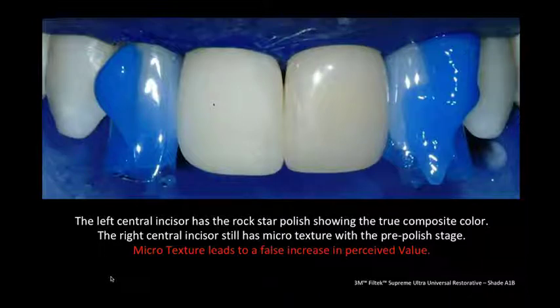Here, what I have is a case that's in mid-treatment. So the left central incisor has the Rockstar polish showing the true composite color. The right central still has some microtexture because it's in the pre-polish stage, just before I hit it with the diamond impregnated polisher. And you can see that even at this fine texture, there is a definite difference in the perceived values. The value of the unpolished restoration is quite a bit higher than the polished restoration.